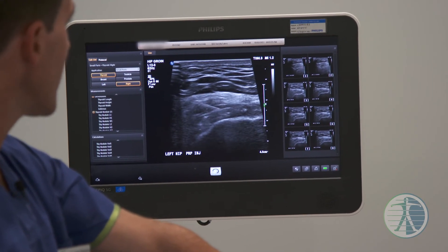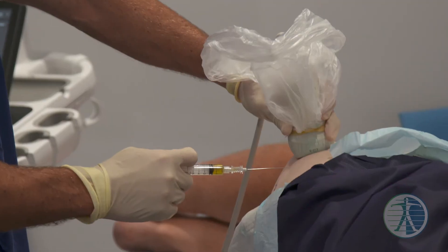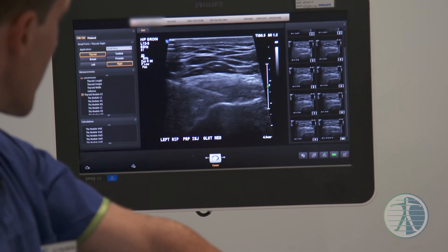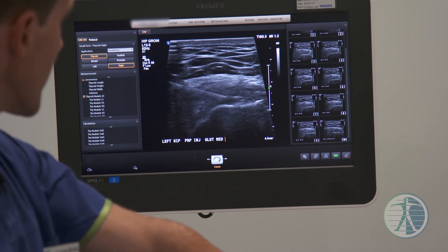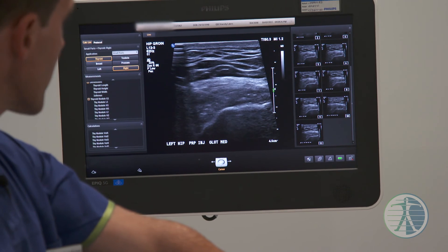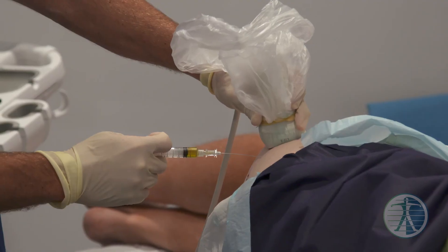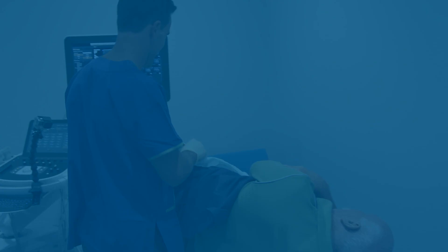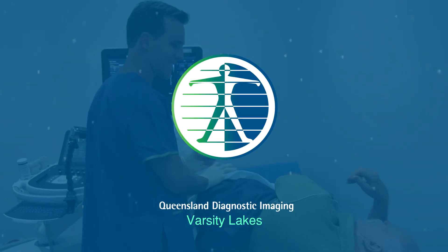We're just putting some in the bursa now, a bit more at the front of the tendon — I'm just injecting it and there's that tear there. Well done Randall, hang in there mate, you're doing really well. Good on you mate, you did great, you did really well.